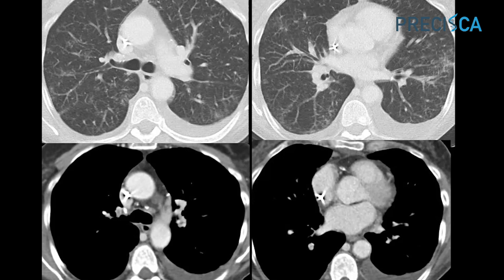This is such an example, where a patient who presented with a high grade colon cancer had developed metastases to the pleura. We could see that there's some enhancement of the pleura with a pleural effusion. But what was very nefarious in this condition was that the lungs were showered with tumor microembolic disease.